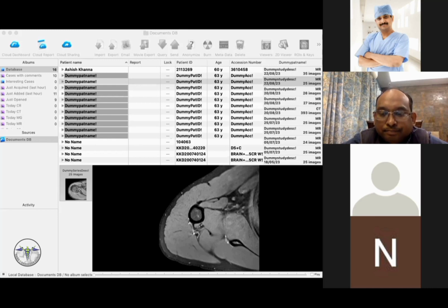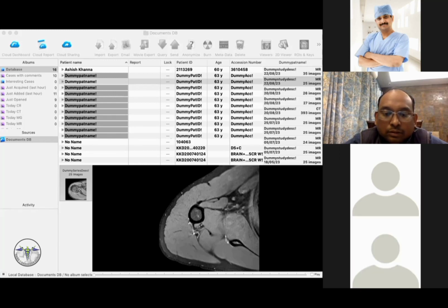Hiba, you want to ask anything? Sir, is there any X-ray view possible to identify bipolar lesions, or are MRI or CT scan a must?